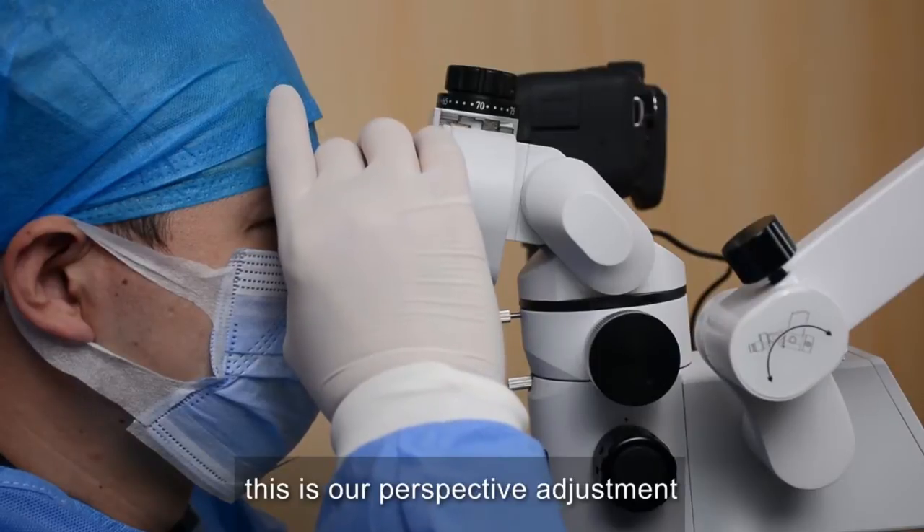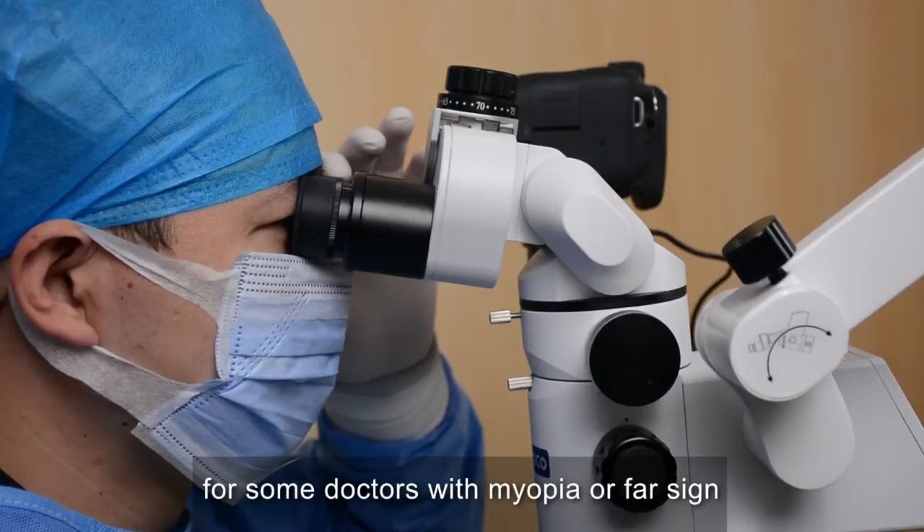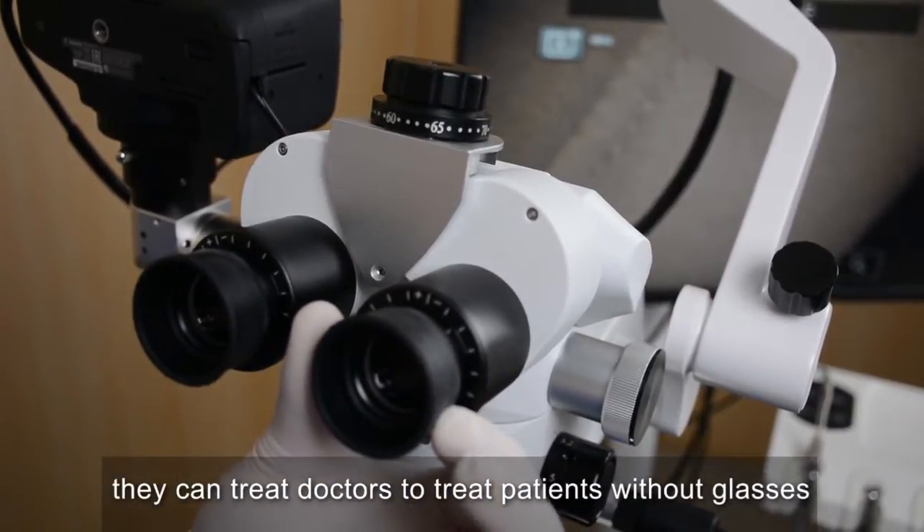This is our diopter adjustment. For doctors with myopia or presbyopia, it allows doctors to treat patients without glasses.